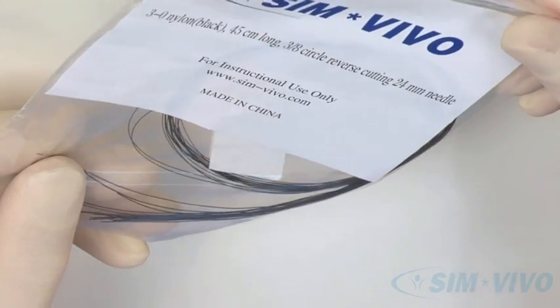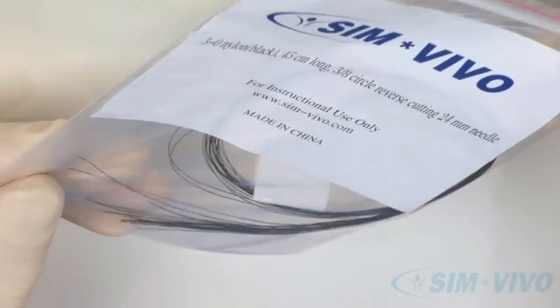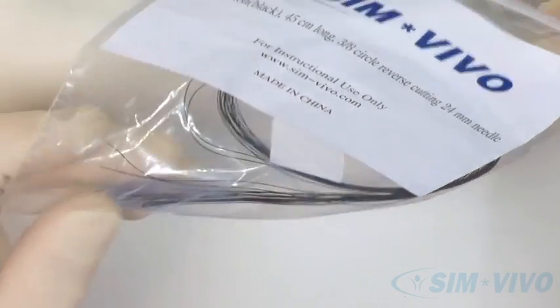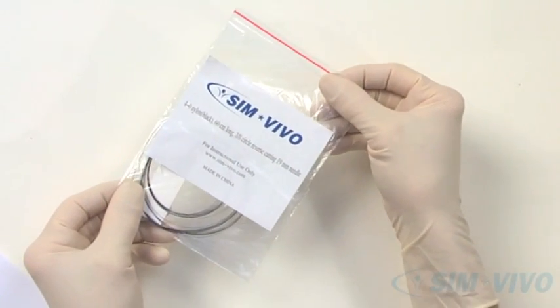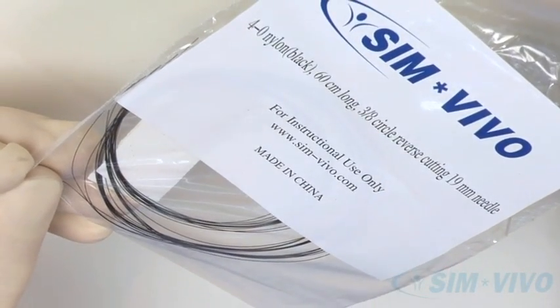Another bag contains a 3-0 nylon with a 24 mm curved reverse cutting needle, which is a needle commonly used to close lacerations and incisions. The final bag contains a 4-0 nylon with a 19 mm reverse cutting needle, which will be used for practicing subcuticular closure.